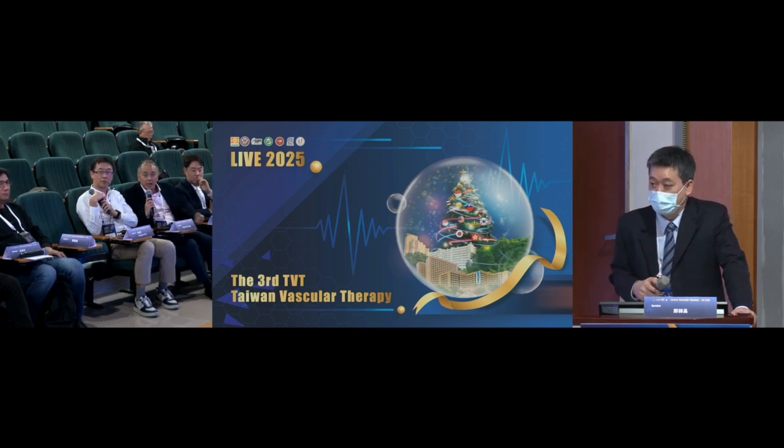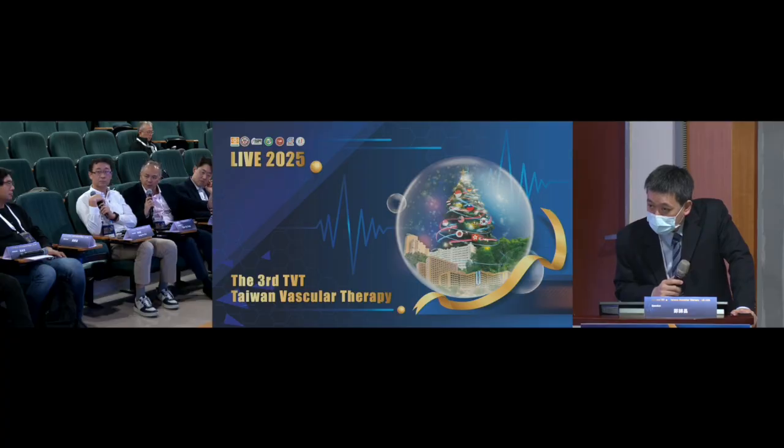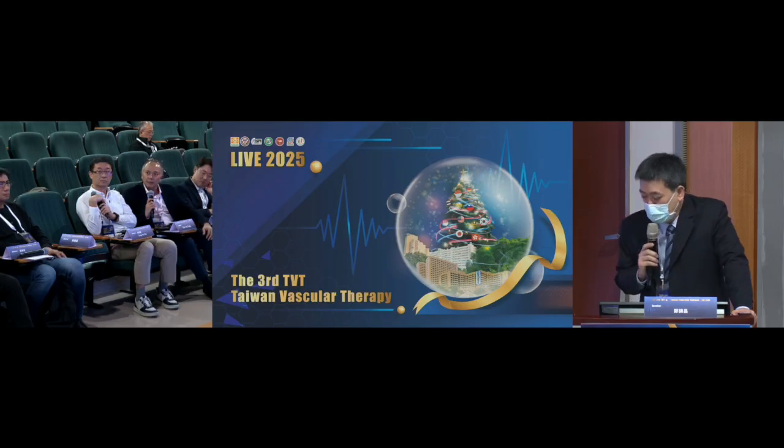Thank you very much. Can I ask you two things? Number one, what is your rationale for treating the left side before the right side? You're mentioning left before right, and then superior portions before the inferior portions. And the other thing is with BPA, what is your experience of recoil? What is the recoil rate of those vessels?